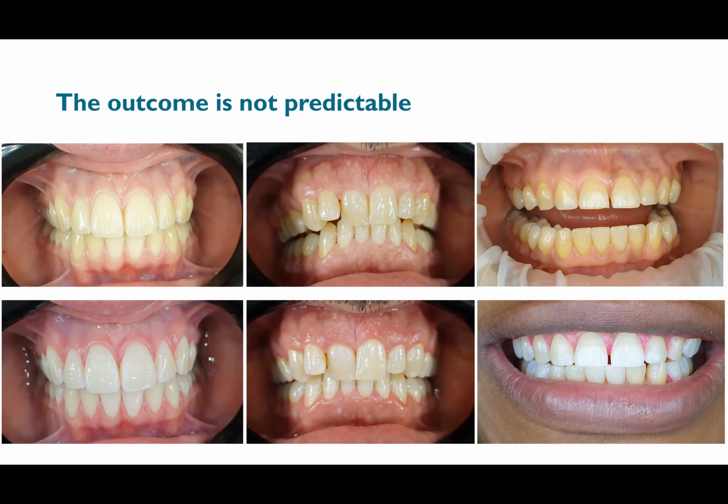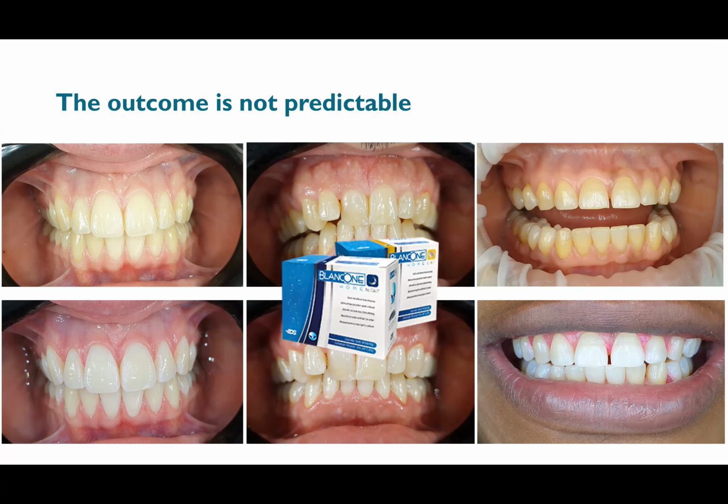But we had talked about this in the beginning, saying, okay, your teeth are a little bit more orange, so it's going to be a little bit more difficult to change the color. We can start with the click and see the results. We obtained these results, and then I said, if you want more, we can use the home bleaching. We made some whitening trays, and the patient did 1 more week at home.